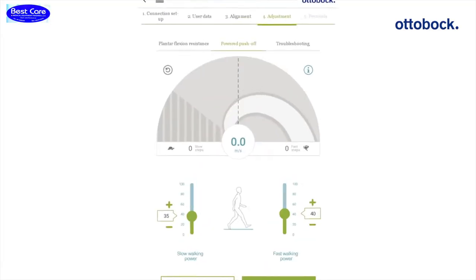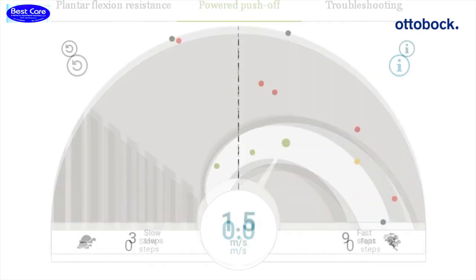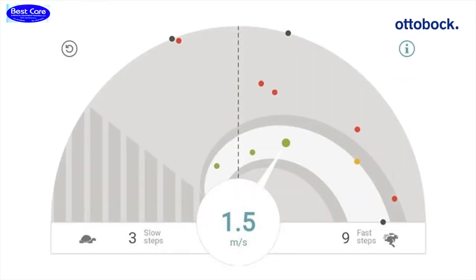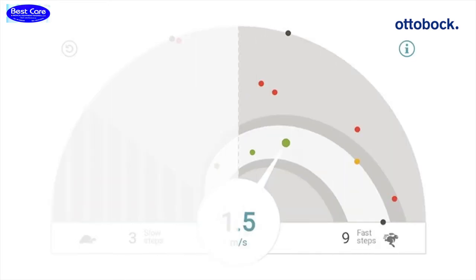The second step is the adjustment of the Power Push Off. This setting adjusts the amount of power that is output by Empower during Toe Off. The dots in the graphic show the steps taken by the user at various estimated walking speeds. The graphic is designed like a speedometer — moving from the left to the right, the walking speed increases.